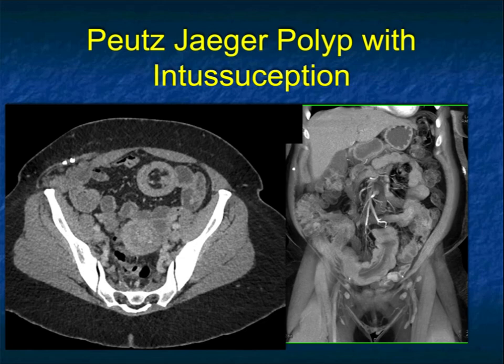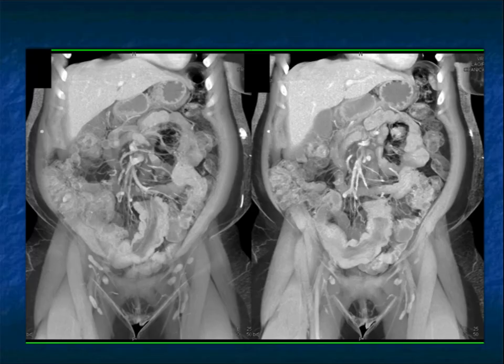This is a patient with Peutz-Jeghers syndrome who had a polyp, and you can see the intussusception. A beautiful example of intussusception — here's the fat being pulled in, here's the intussusception right here. Two very classic axial and coronal views, very important to be able to recognize. Here it is on 3D, where you can see the vessels being drawn in off the SMA.